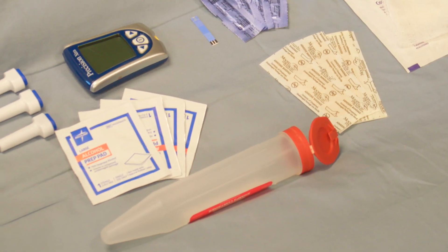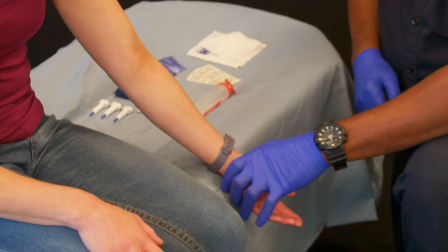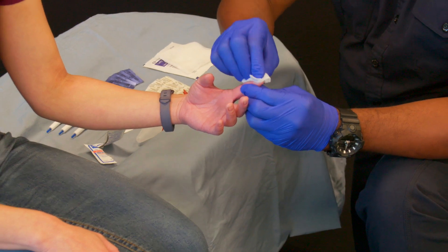Once I have all my equipment ready, I'll explain the procedure to the patient. I'll turn on my glucometer and place the patient's hand in a dependent position for 10 to 15 seconds. Then I'll take the patient's finger and clean it using aseptic technique, using the alcohol swab.